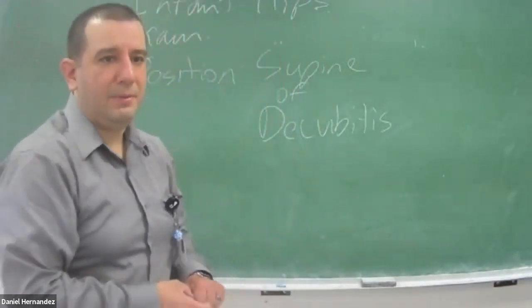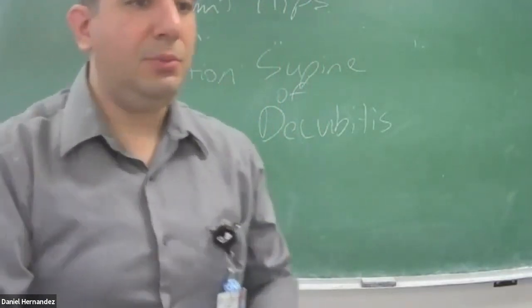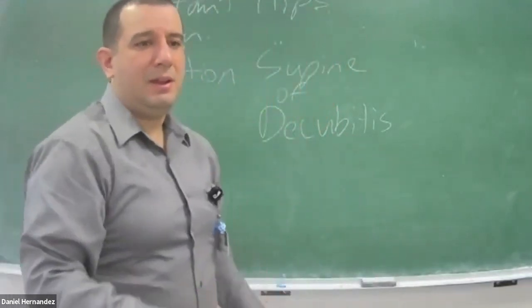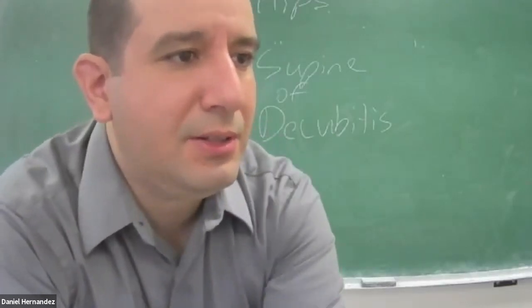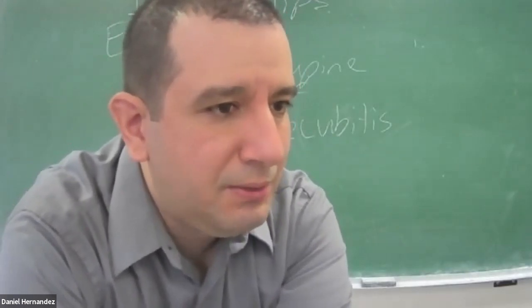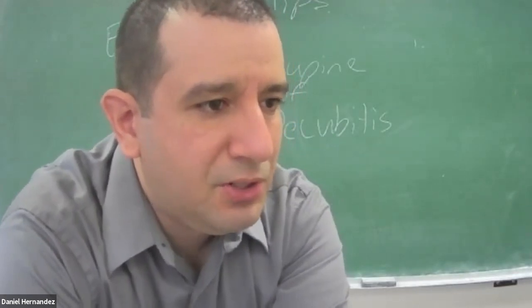The sonographic examination for a DDH evaluates the degree to which the femoral head is covered by the labrum, as well as the position of the femoral head in the acetabulum at rest and during motion and stress. Throughout the examination, the sonographer is able to assess the position and stability of the femoral head, in addition to assessing the development of the acetabulum. The stability of the hip is determined through guided motion and application of gentle stress.